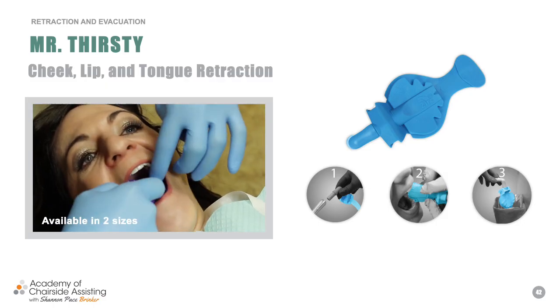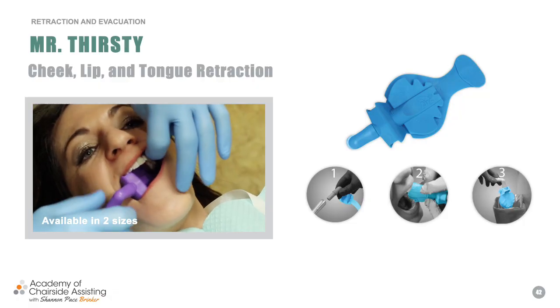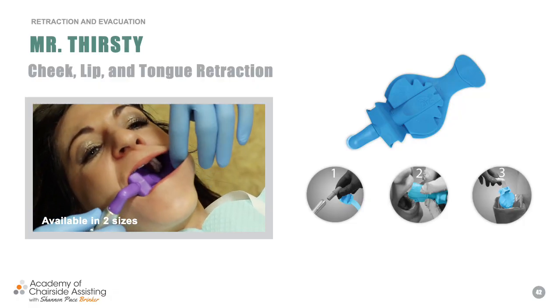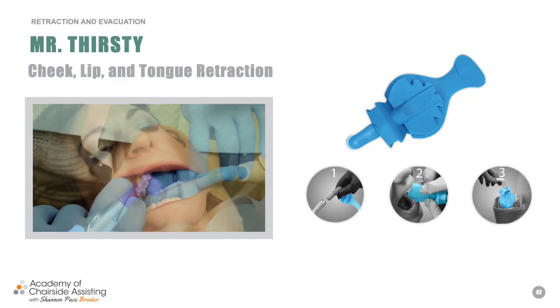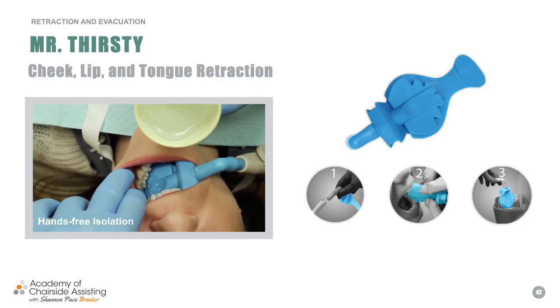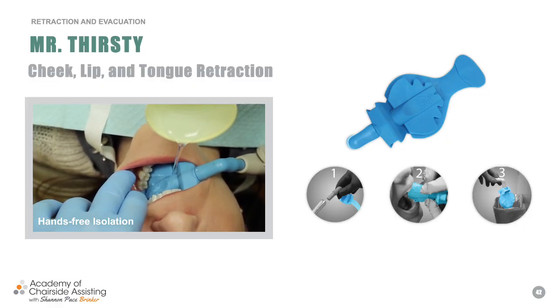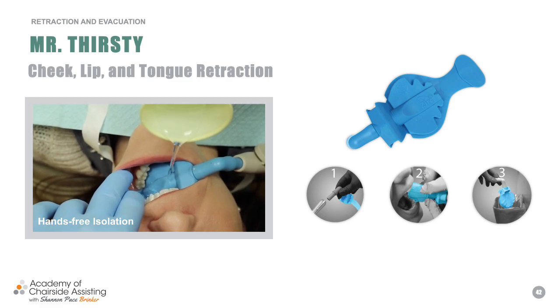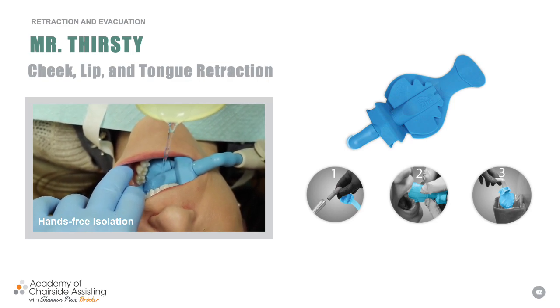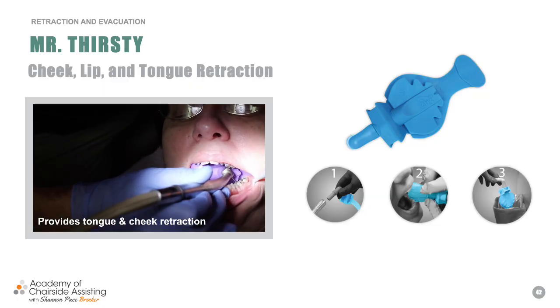Comes in different sizes. And we have the full video after the module, so you can watch at your pleasure. If you really want to spend some time looking at each one of those, we have put in the full video. But here you can see where it can suck up a whole lot of water. And we can just imagine that being saliva works really nicely. So again, so many options, right? You're like, oh my gosh, how do I know what to utilize? Really is a conversation for you to have with your dentist, and you both decide, okay?